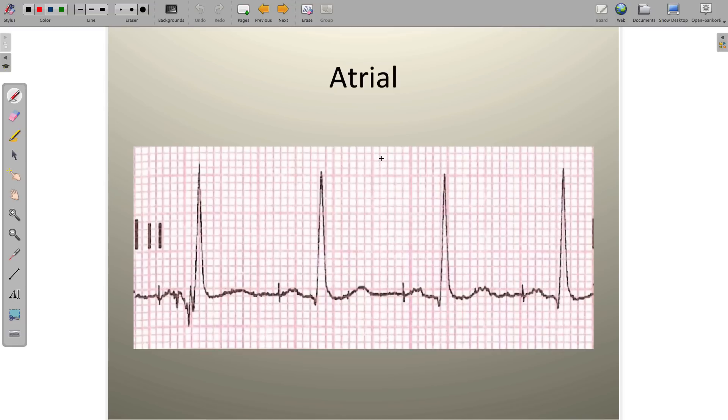An atrial pacemaker is characterized by a spike — a very rapid, single moment in time spike — and immediately following that spike, you'll have what appears to be a pretty normal P wave. Anytime there's a single spike followed by what appears to be a reasonably normal P wave, with the QRS of normal duration and the QRS and T wave pointing in the same direction, we call this an atrial pacemaker.